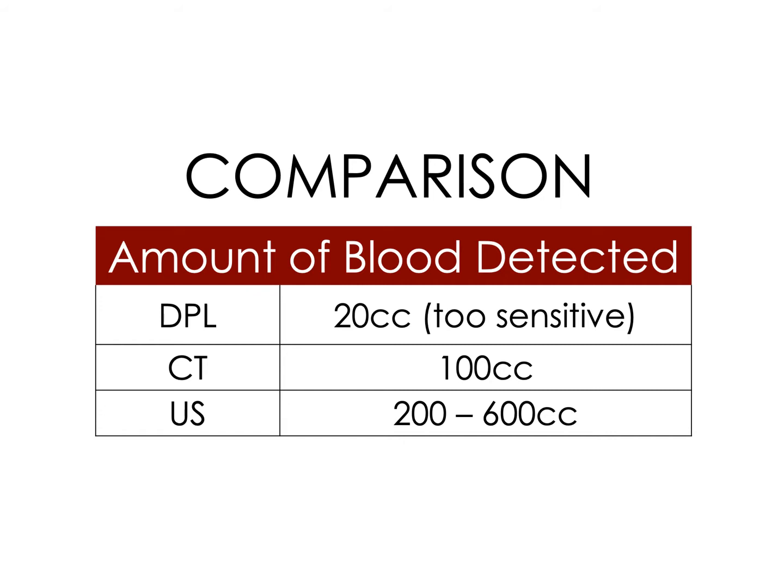Ultrasound is very difficult to get a specific number for, and part of that is that there just isn't a good way to do a study like this. A lot of the early studies involved slowly infusing fluid into a cadaver or a pig and having sonographers do repeat studies until they decided it was positive and seeing how much fluid that had taken. That's obviously not a very good scientific test.